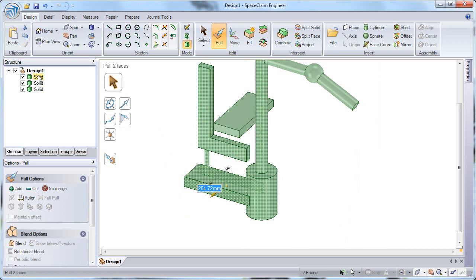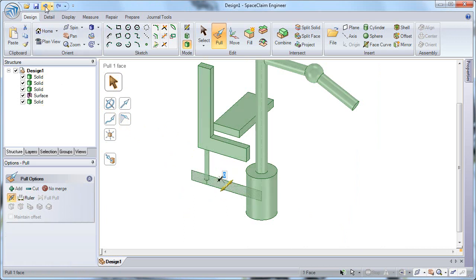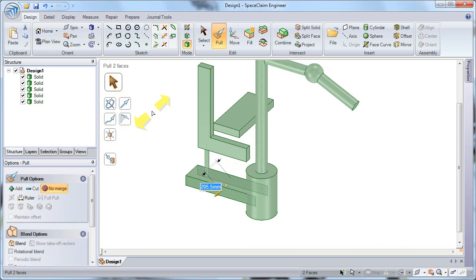And so we don't want that to happen, so let's undo from our Quick Access toolbar, and instead let's toggle on this option on the left, No Merge. So now when we pull both sides and we have our No Merge option selected, either in the options on the left or from our tool guide, we'll be able to expand out that surface into a solid, but you'll notice that in the structure tree it does not merge with any of the other solids that it collides with.